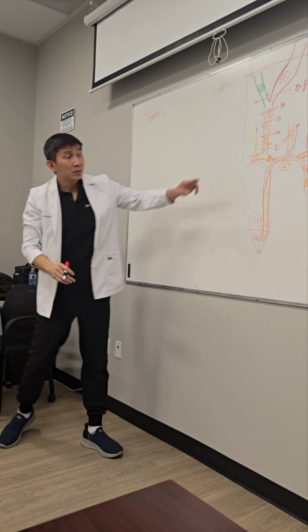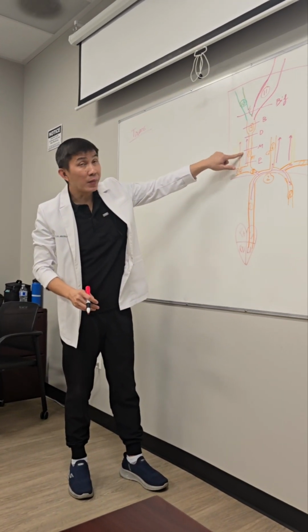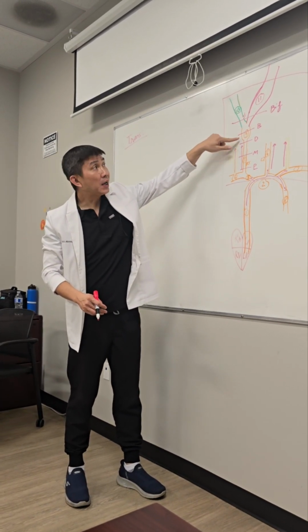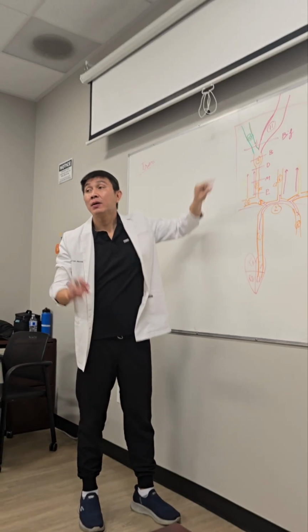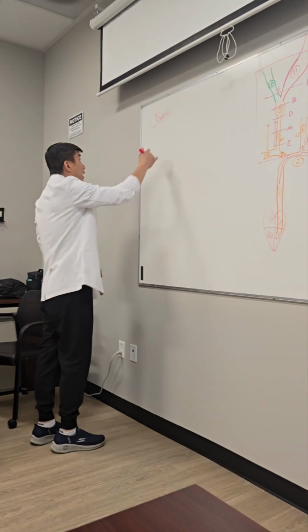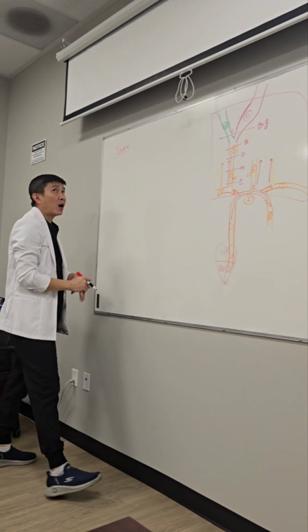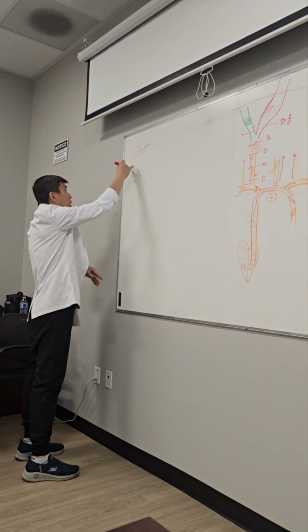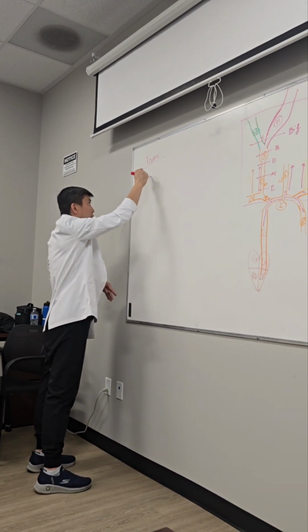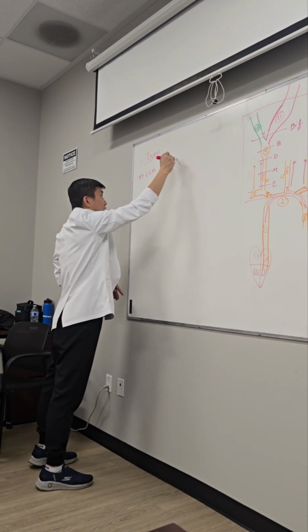Okay, so for the transverse, we're checking the proximal CCA, mid CCA, distal CCA, bulb, and bifurcation, in B mode and color mode. You see the prox, mid, and distal are quite simple. You're going to label it right or left, depending. I just write right CCA proximal transverse.